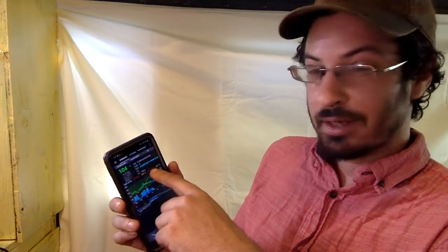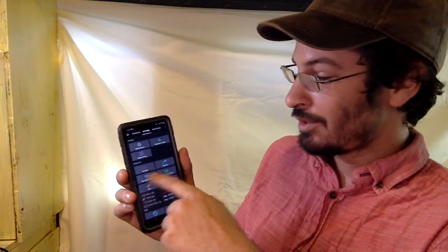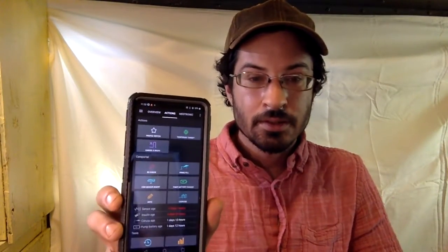My sensor, I forgot, when I go to actions, I should have pressed CGM sensor insert, but I didn't. So my sensor says it's been on for 17 days, but this one's only been on for 3 days. And then the battery of my pump. So I've got temporary targets I can add. I can switch my profile. I can add a temp basal, especially when you're in open loop. I can check my blood sugar, and this will send that data straight to Xdrip, so it'll calibrate for you.